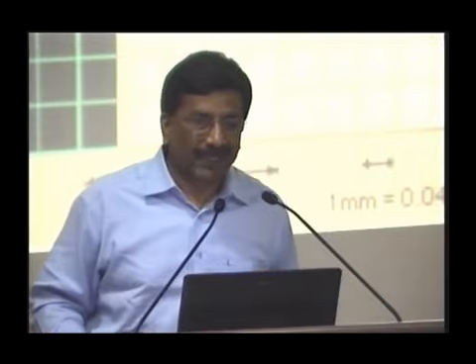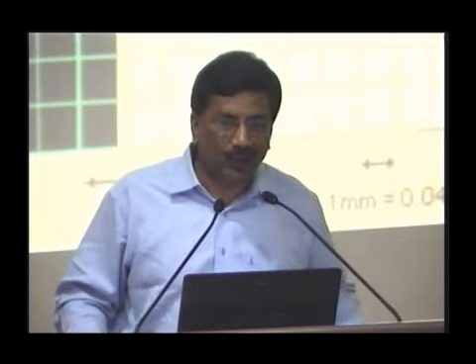For PR interval, the number to be remembered is 12 and 21. P wave, what number? 2.5. So PR interval, 12 and 21. 12 reversal is 21, isn't it? The PR interval should not be less than 0.12 second and should not exceed 0.21 second.